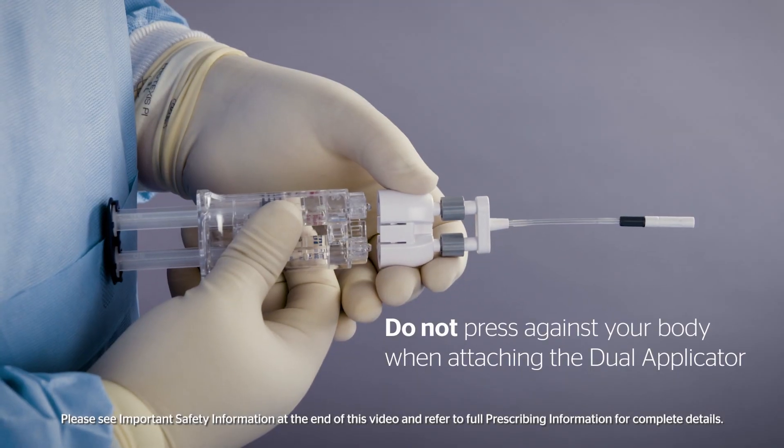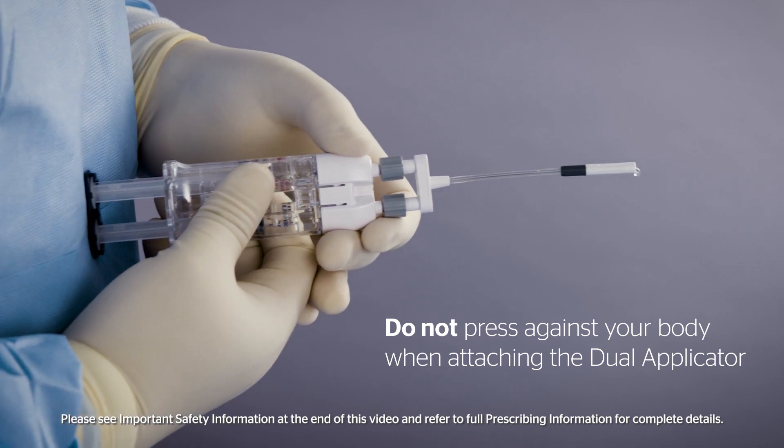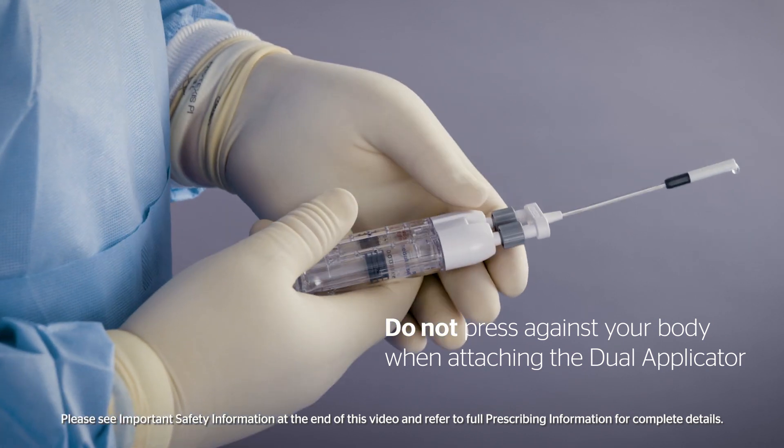Do not press the plunger against your body when attaching the dual applicator. It is critical that the OR team does not depress the plunger until its intended use.